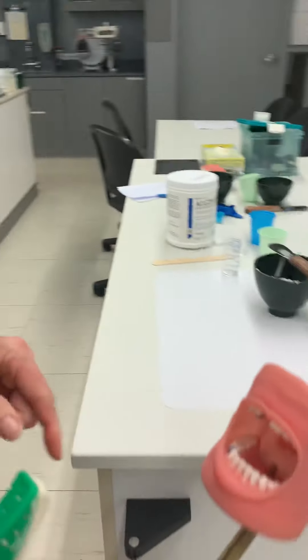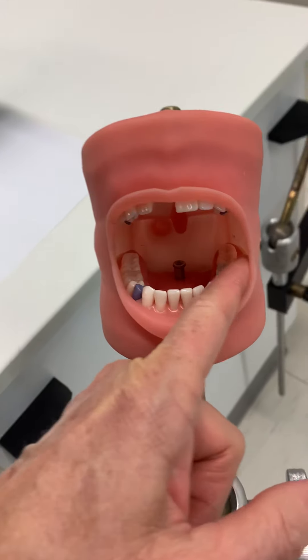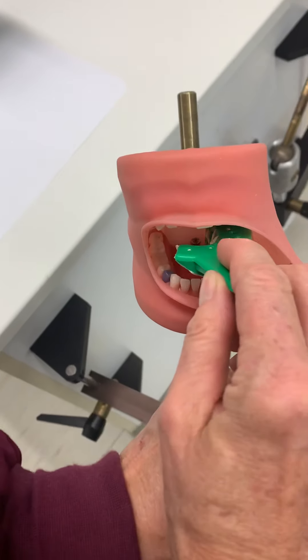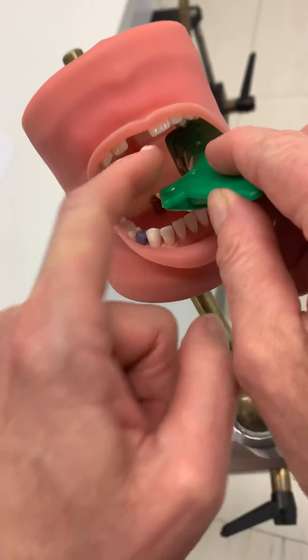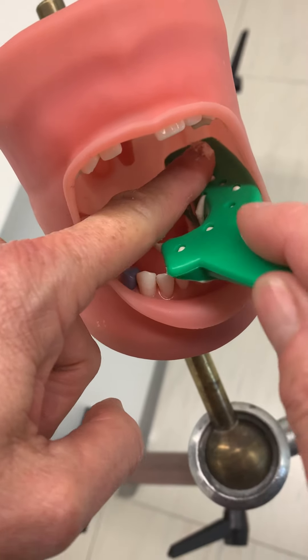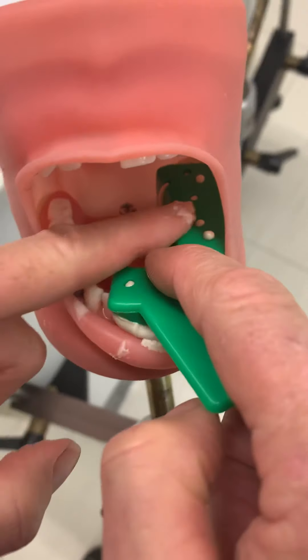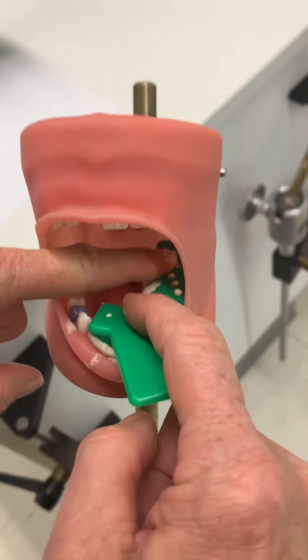We're going to take our impression on the lower left side. I'm going to retract the cheek, go into the mouth of the typodont, go back to the distal, and seat the tray in one motion. Bring the cheek out and the lip out just a little bit, and then hold.